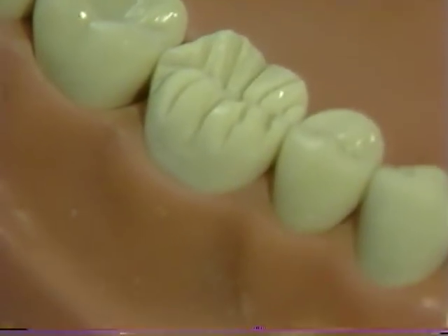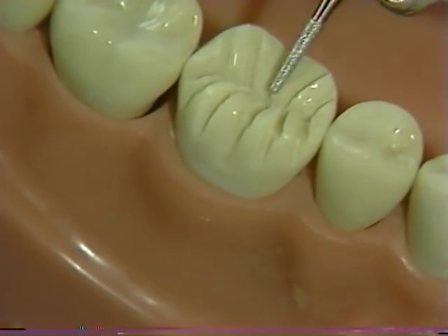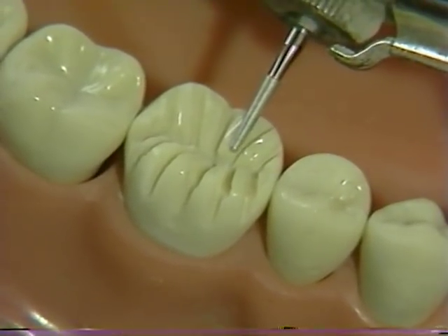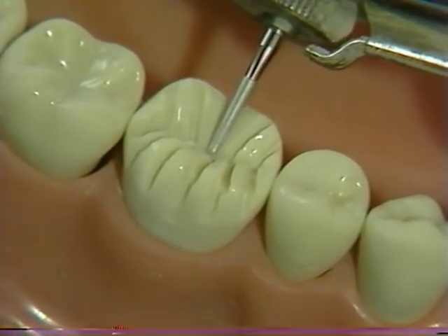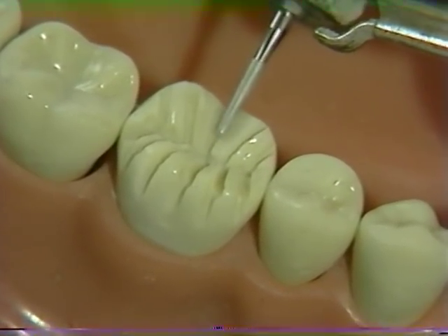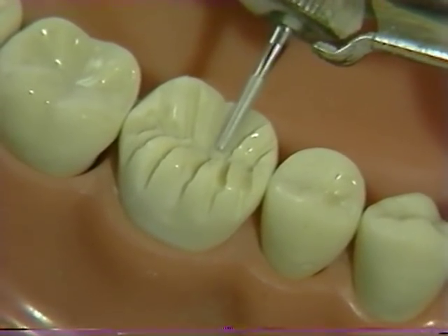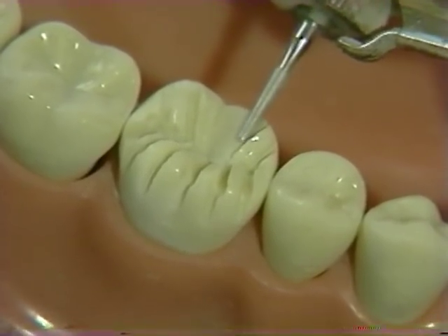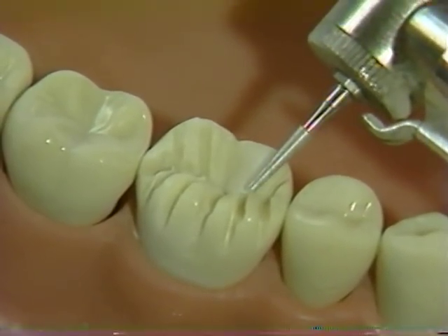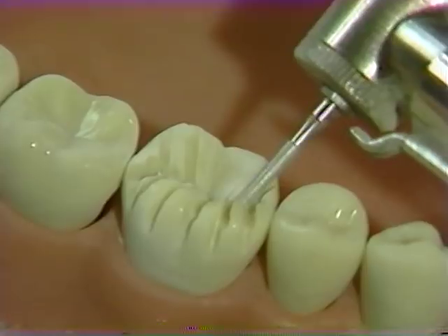The half DT diamond can then be used to remove the islands of tooth structure between the grooves. Remember that first only the mesial half of the occlusal reduction will be completed, and reduce only one island at a time so as to maintain the semblance of the normal occlusal configuration. The depth grooves, of course, serve to standardize the amount of tooth reduction. It is critical that the orientation of the rotary instrument is adjusted for each individual component of the reduction.